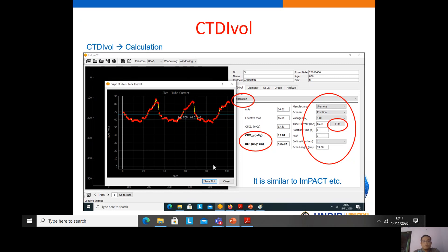In the calculation form, IndusCT is similar to ImPACT CT or other calculators. To calculate the CTDIvol, we choose the manufacturer, scanner, voltage, tube current, rotation time, pitch, collimation, and scan length. After choosing these parameters, we automatically obtain the CTDIvol and DLP.